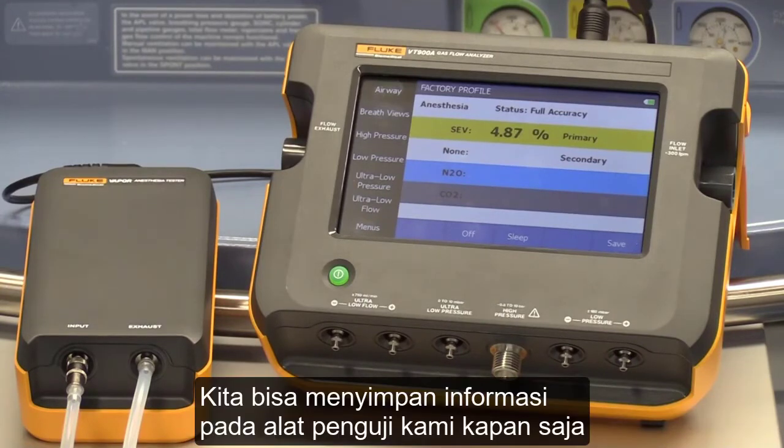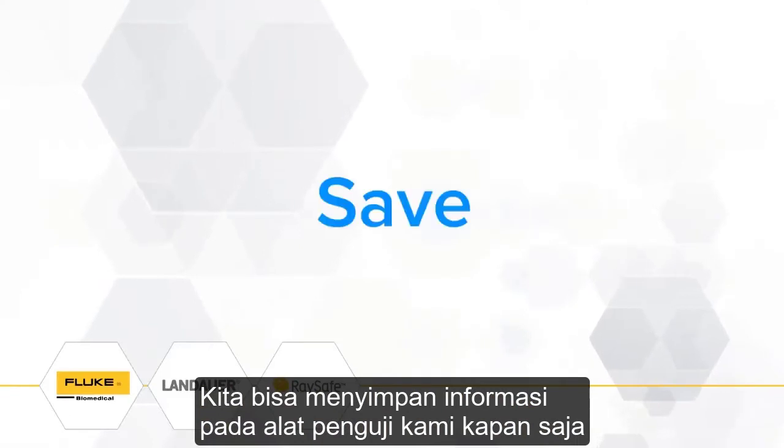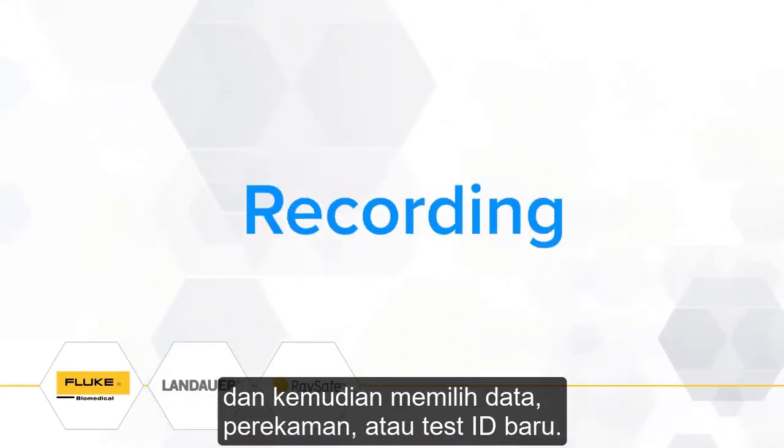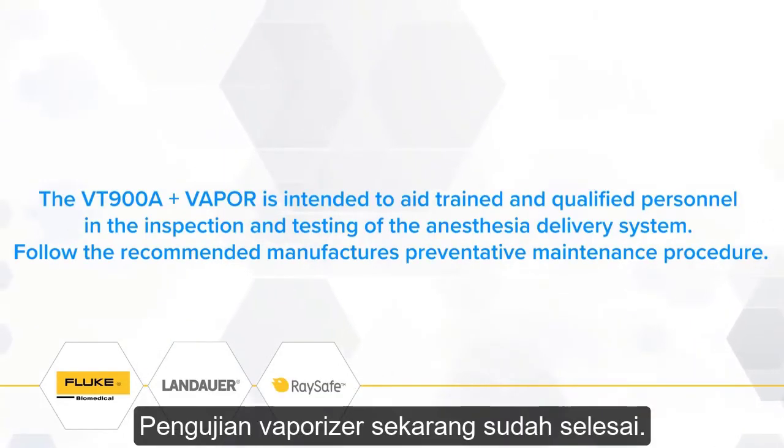We can save the information on our tester at any time by pressing Save at the bottom of our screen and then selecting Data, Recording, or New Test ID. Vaporizer testing is now complete.